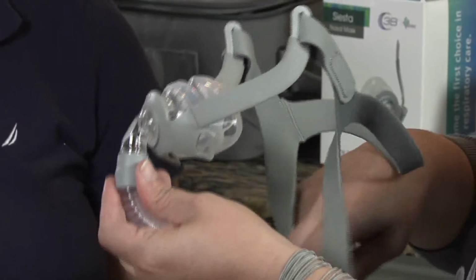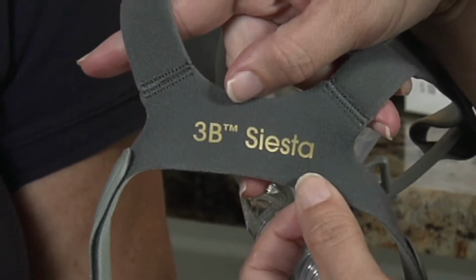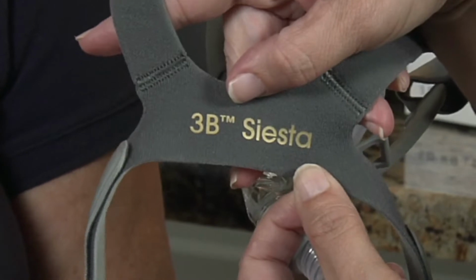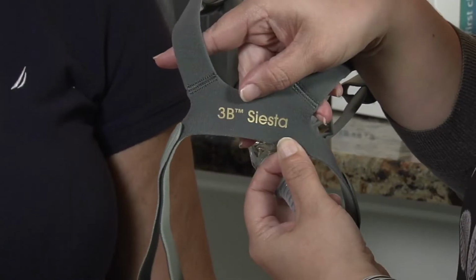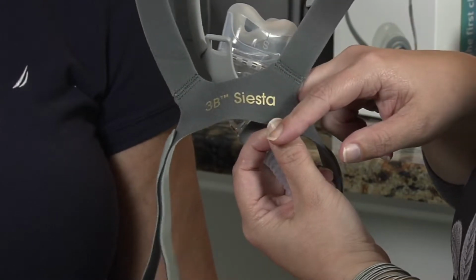All 3B masks have the name of the mask printed on the bottom of the headgear. This helps you to know which mask you need replacement parts for and also which piece of the headgear goes on the bottom of your head.